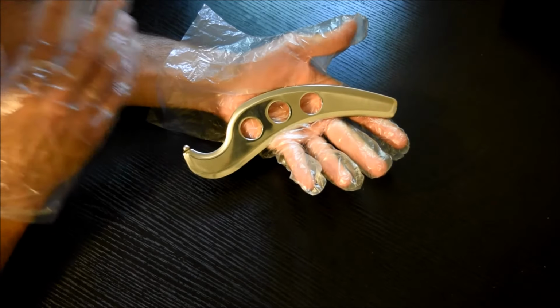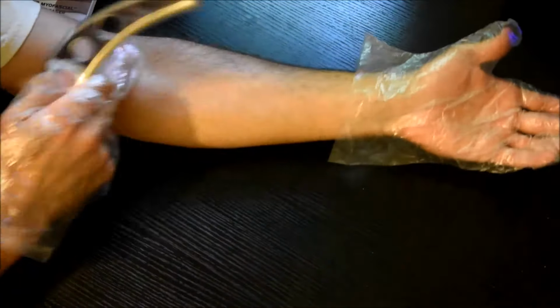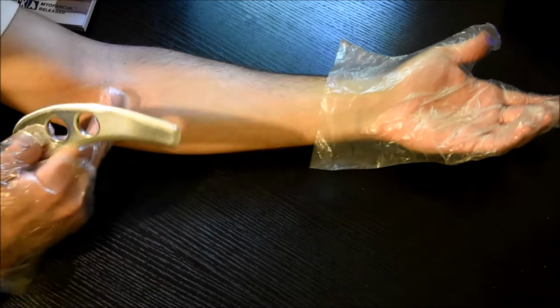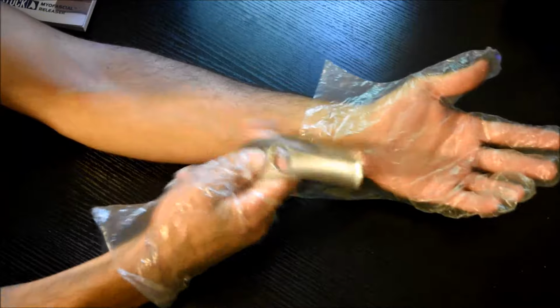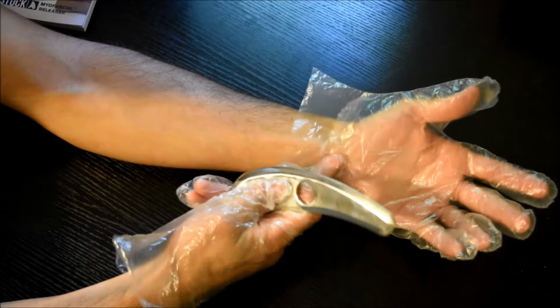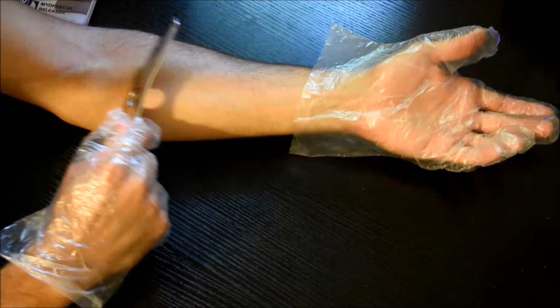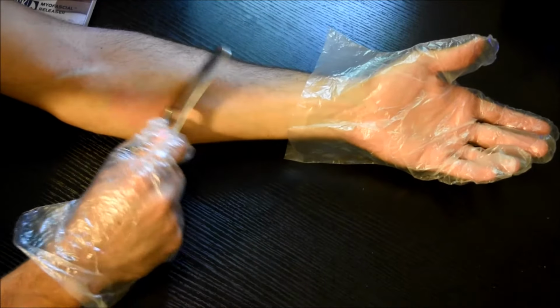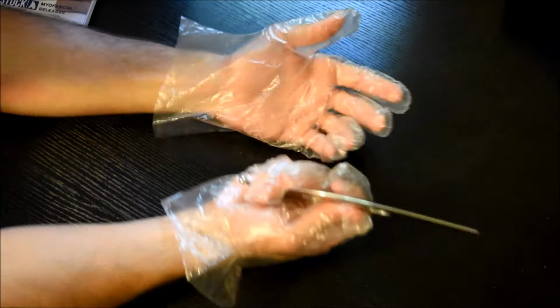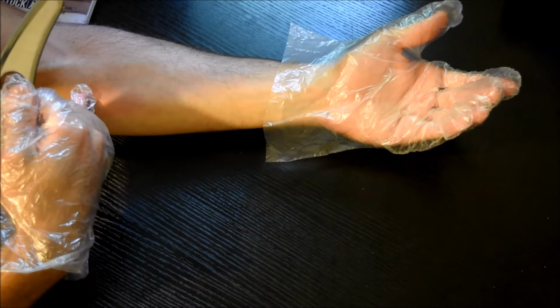So it's pretty simple. Once you've found the restrictions or the adhesions in your patient, let's imagine that we're working here on the forearm. These muscles originate here on the medial epicondyle, and they are the wrist and finger flexors. If your patient is dealing with some tightness along here, maybe some carpal tunnel or golfer's elbow, there's probably going to be some restrictions here, and you can use the tool itself to scan and to diagnose. When you're feeling for adhesion, you'll feel a grittiness. Some level of grittiness is normal, but when you compare it to the unaffected side, you'll notice there's more grit, and that's basically scar tissue under the skin in that fascial layer.